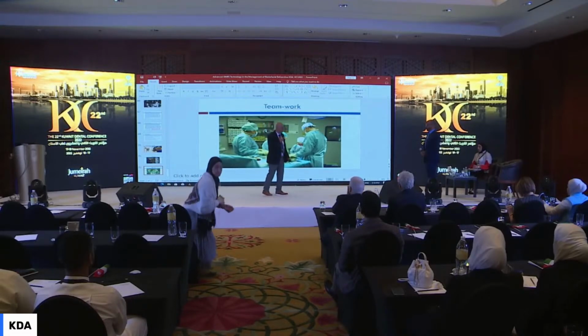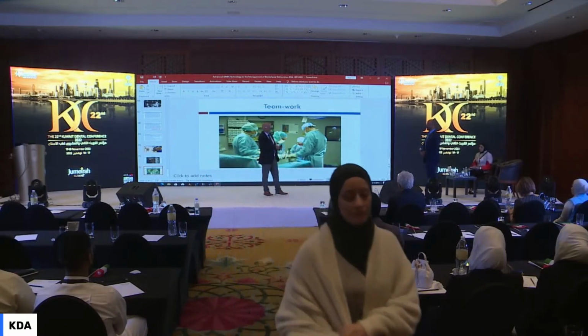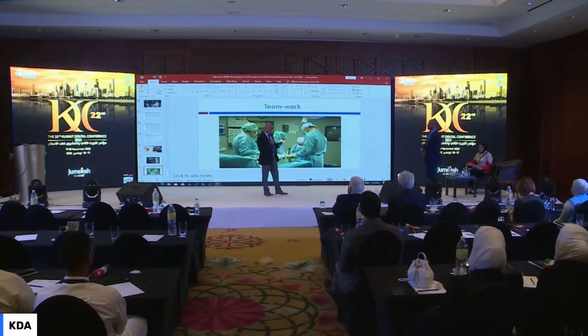not more than 1 millimeter, and then take a picture. The hair, you will have defects in it. Now you can have another software trying to fill the defects, but heavy hair, probably I can do it for you. This is not considered heavy hair. So I can do you facial scanning, but anything more than that, facial hair, it will be difficult to capture and you will have a defect.